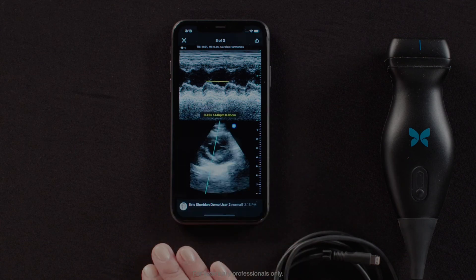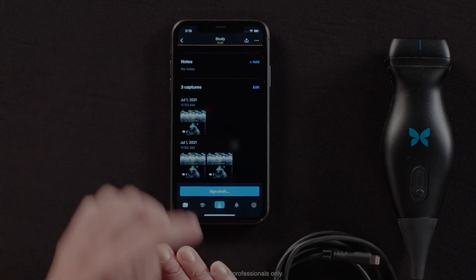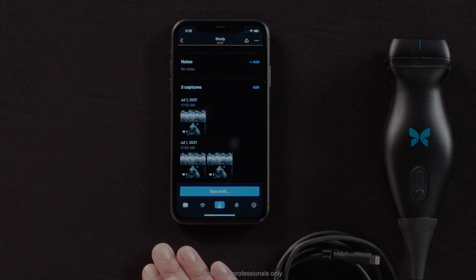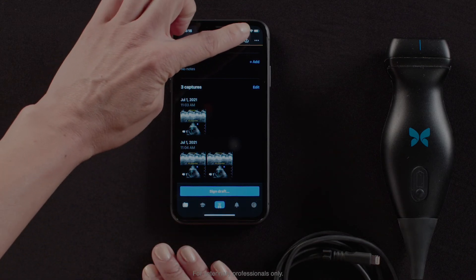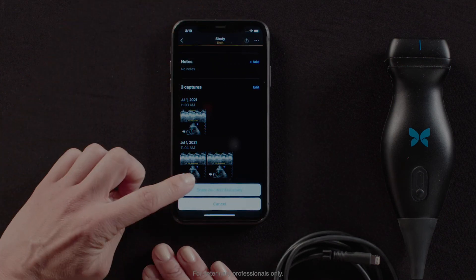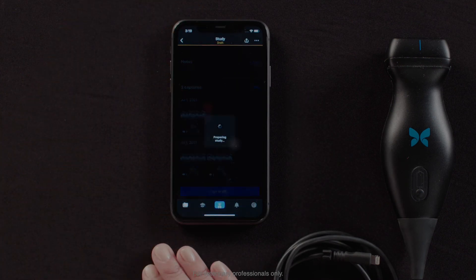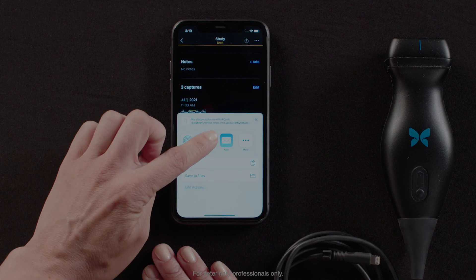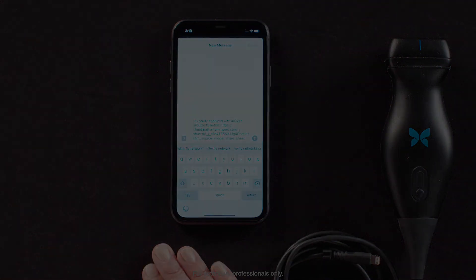If I X out, I can share the entire study by tapping the up arrow in the top right hand corner, share de-identified study, and share the study via text message or email.